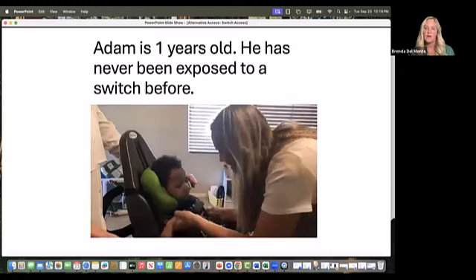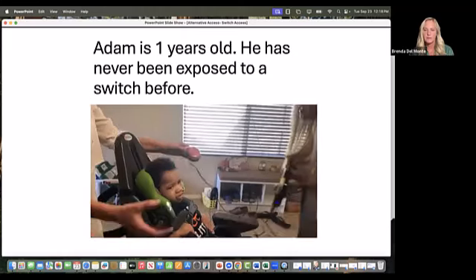His vision wasn't strong enough for eye gaze, so he's a switch user.